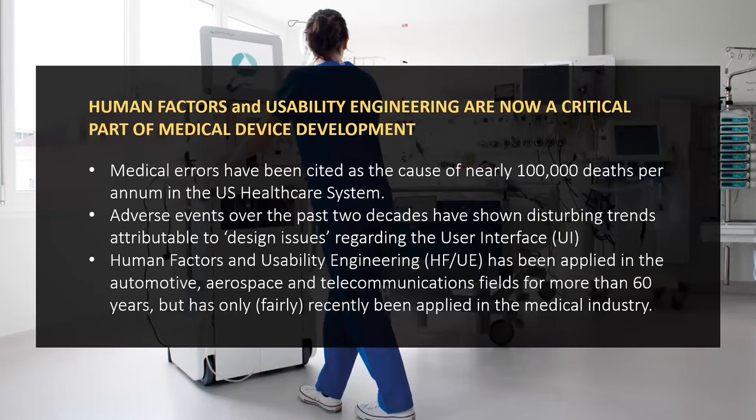So this segues very nicely into what we've just been talking about, that human factors and usability engineering are now a critical part of medical device development. By the way, I won't try and talk to all of these points. The slide deck will be available to anyone who wants it afterwards.